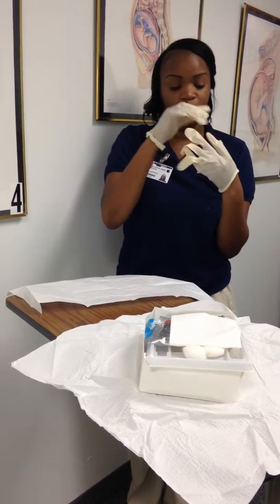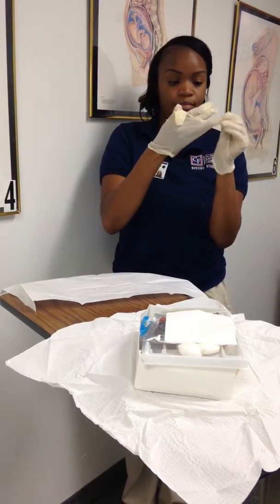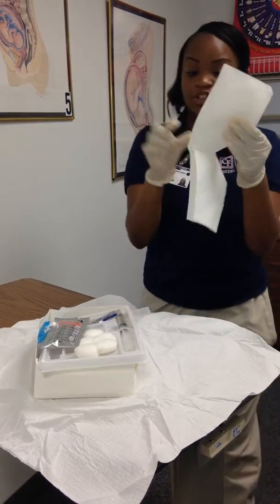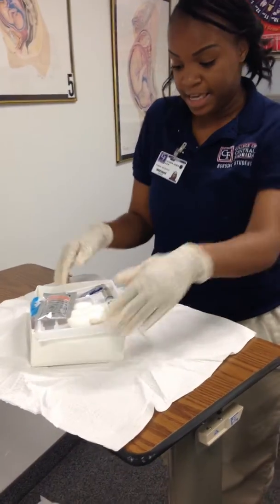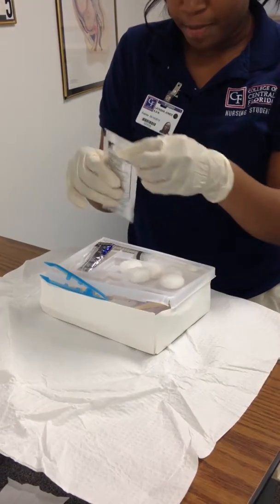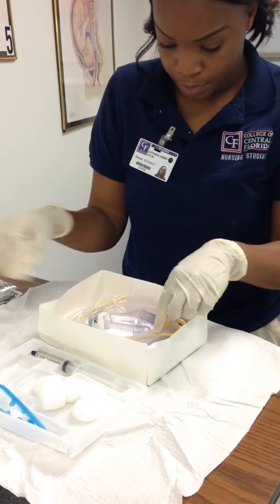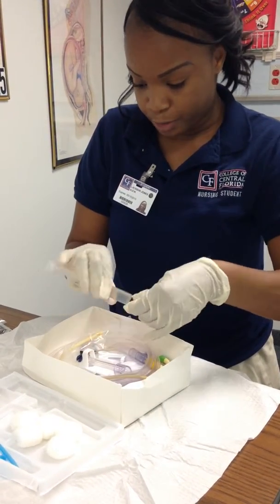Now, once I have on both gloves, I can go ahead and correct my fingers. Go ahead and take the fenestrated drape. Just lightly drape it over. Now I'm going to go ahead at this point and check my kit. I am sterile. So I'm going to go ahead and open up my iodine, put it over my cotton balls, open up my lube here. I'm going to take my syringe, insert and attach it to the hub to make sure that it works properly.